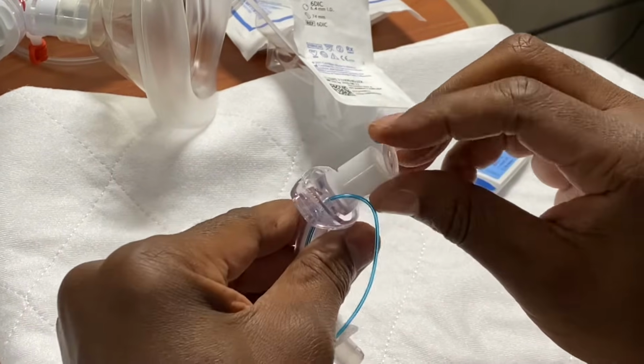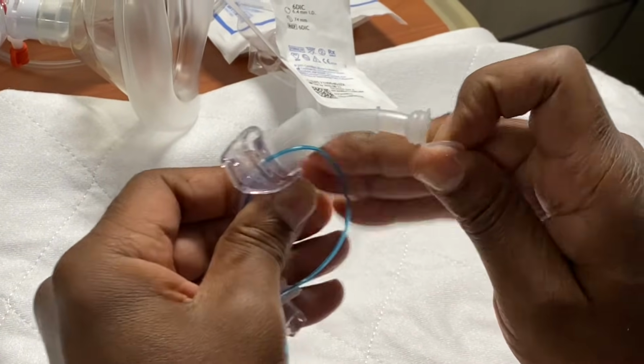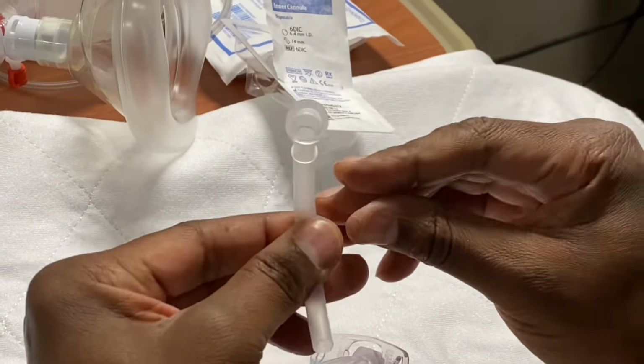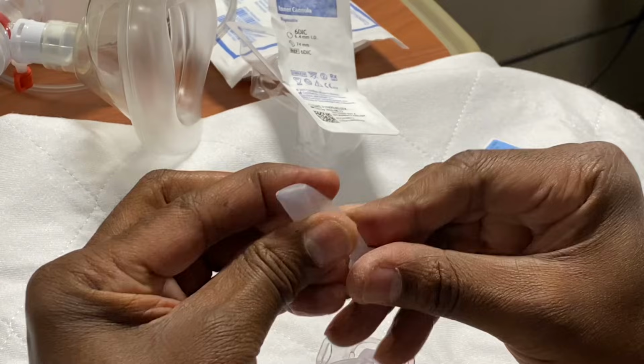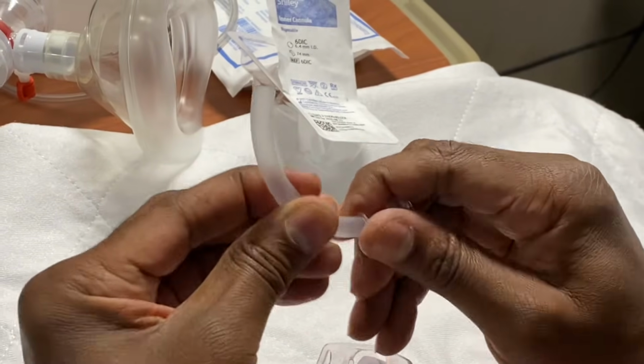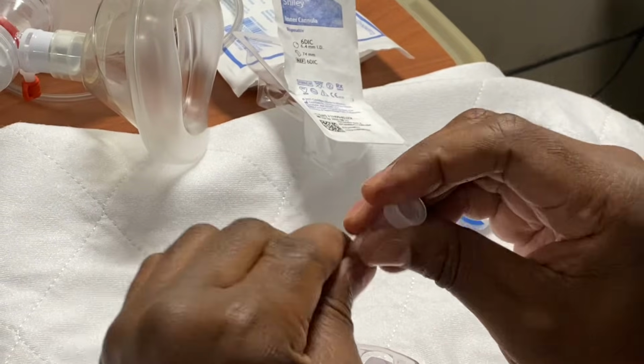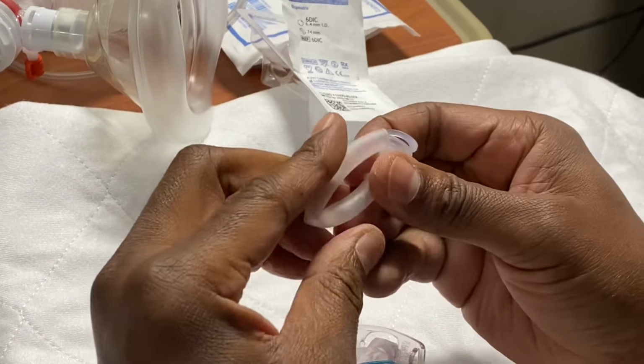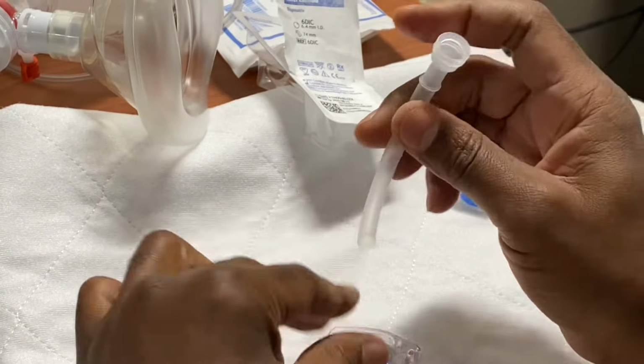This has an inner cannula that it just pulls out like this. It's just a little handle. And the difference in the inner cannulas is this is bendable, so it makes it disposable. It's bendable. You can squeeze it. You can flex it. That's disposable.